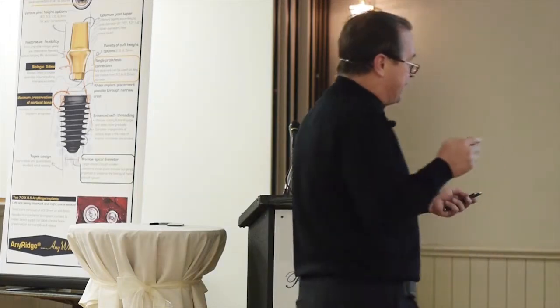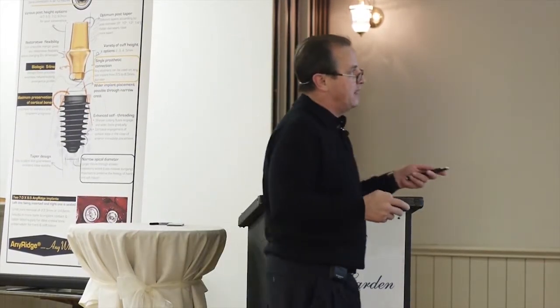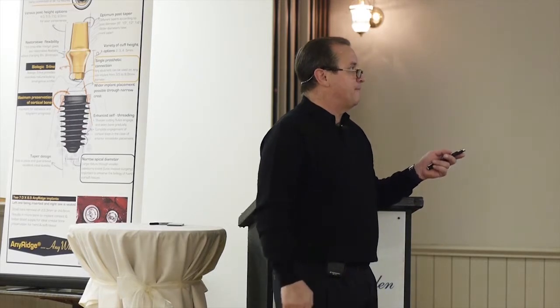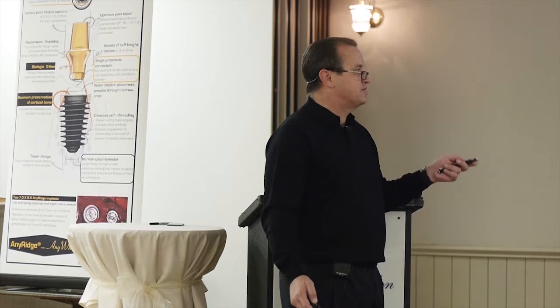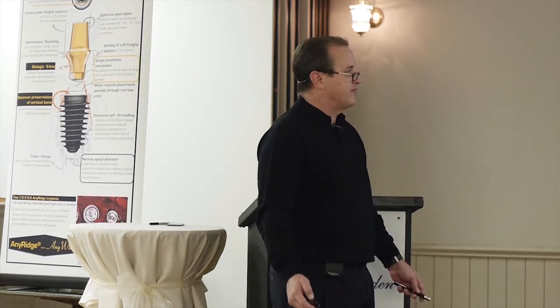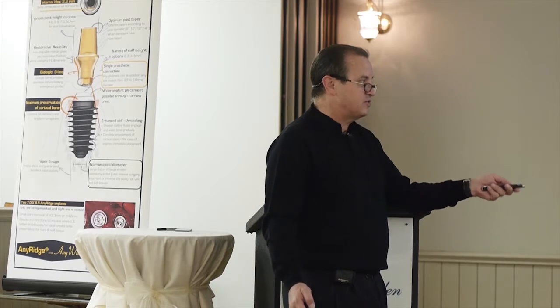So a little bit about the Prexion machine. We can look at the time balance and see if that's something we really want to get into in any kind of depth. But we're able to see things and show patients things that I just never could do with conventional radiography, including if they've got some sinus disease. We can even show them what that looks like using the scanner.